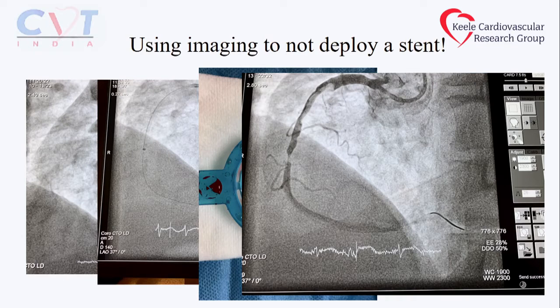Many people would say, well, okay, you've ballooned it, just fix it, put a stent in there. I've shown it to my colleagues. They all said, yes, put a stent in there. Why are you imaging?